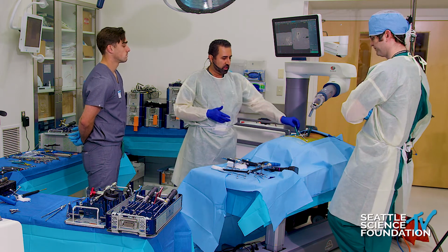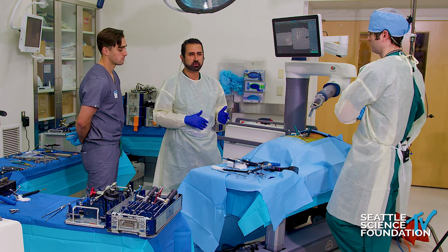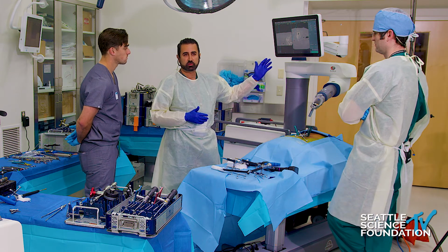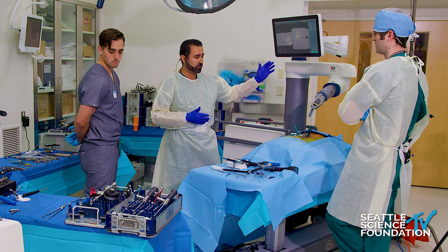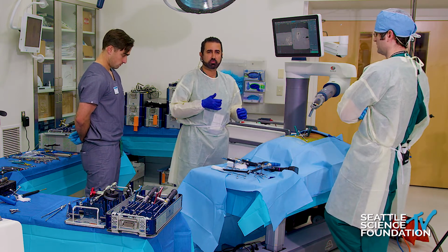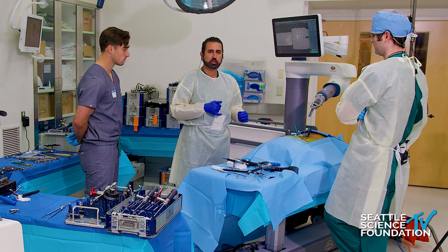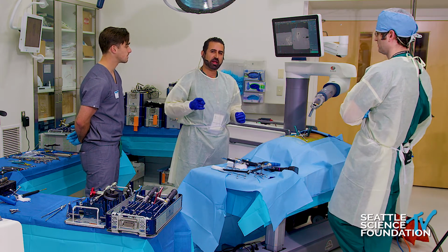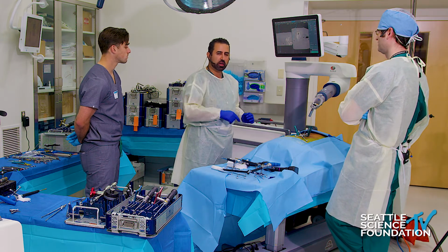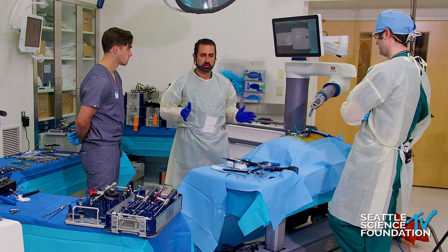For those of us that have done a lot of robotics and we're past that learning curve, once I trust the navigation, it really matters that the registration's accurate and it makes sense. I actually don't constantly look at the screen. I use the tactile feedback from the instrumentation that I'm placing to guide me. To the point that, on the flip side, when I've lost that tactile feedback while putting a screw or an instrument down the end effector of the robot, I disbelieve it.